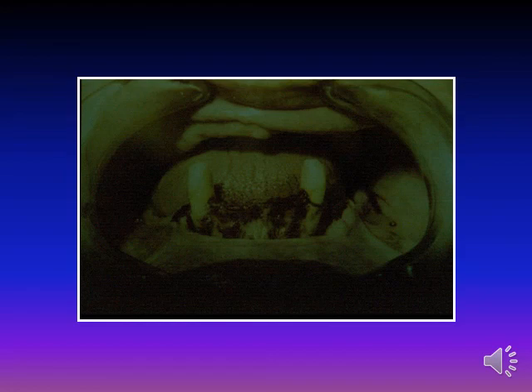The prosthetic causes: abnormal denture pressure from ill-fitting denture bases, inadequate balanced denture occlusion.